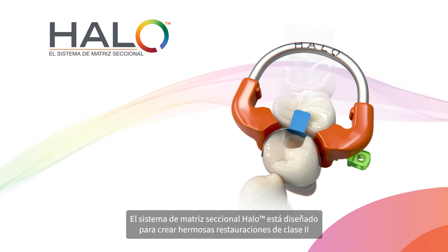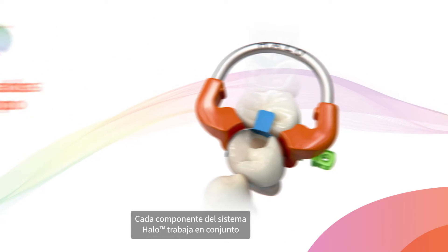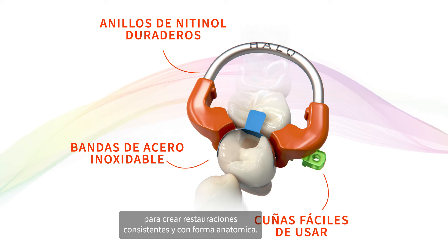The HALO sectional matrix system is designed to create beautiful Class II restorations. Each component of the HALO system works together to create consistent, anatomically shaped restorations.